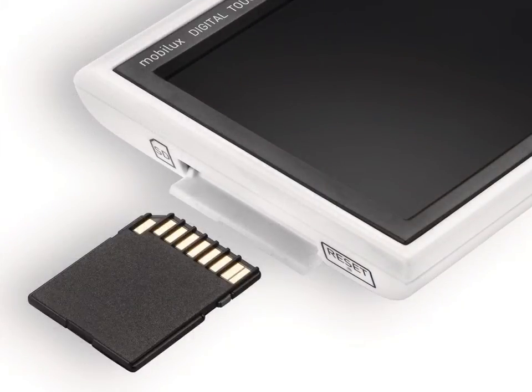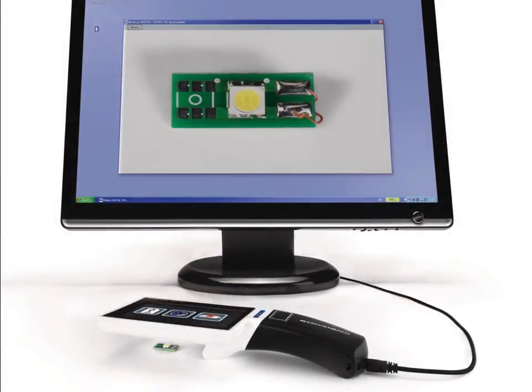Finally, the MobiLux Digital Touch HD offers the added function of being able to install a secure digital or SD card, allowing the device to take and save high-quality photographs. These images may then be displayed upon a computer screen. In this mode, the device can also be used as a magnifier again, and with connection to a larger monitor, allows for even higher levels of magnification.